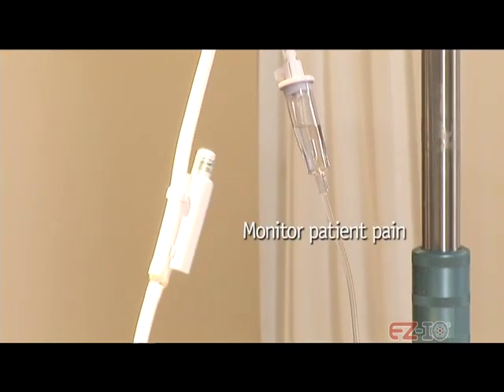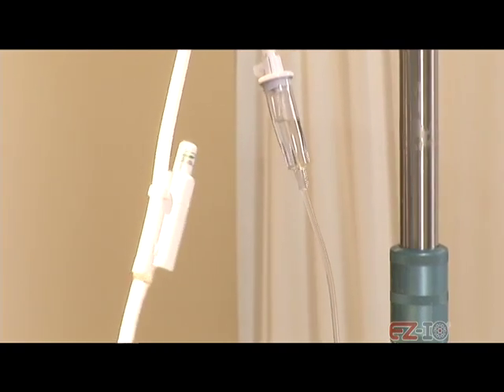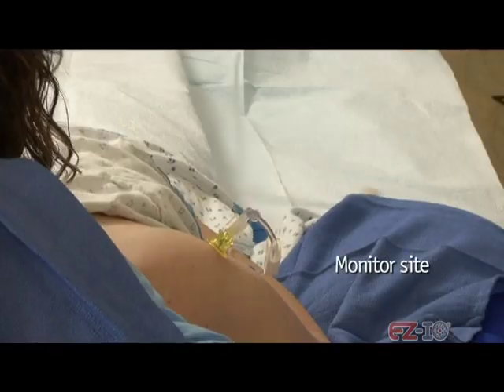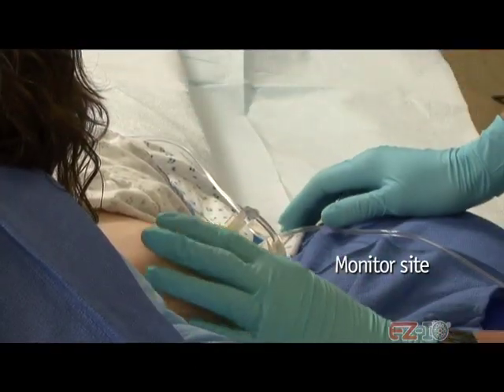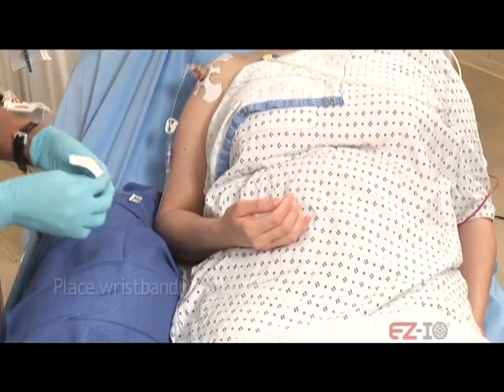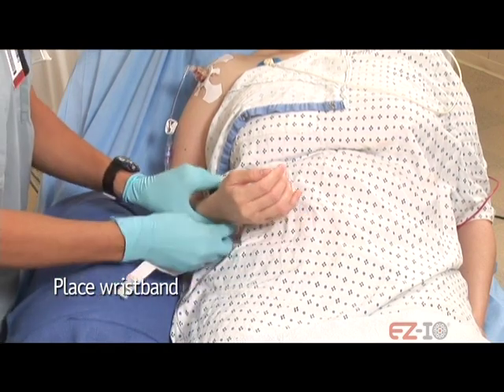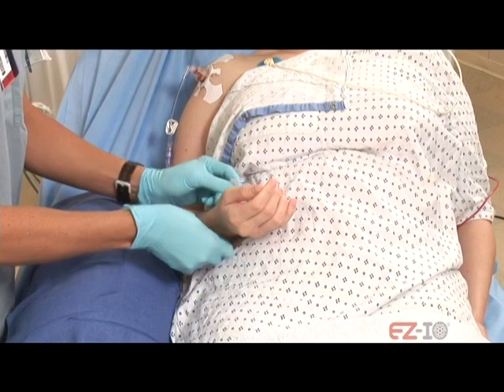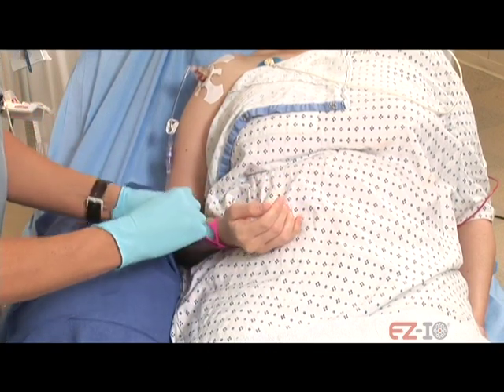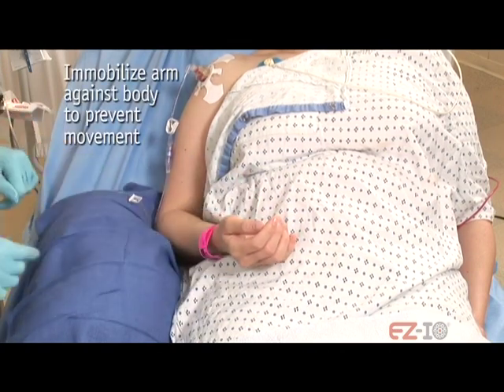Monitor the patient's pain during infusion. Consider repeating lidocaine as necessary for pain control as allowed by institutional policy and procedure. There we go. Monitor the infusion site for signs of extravasation. Good there. All right. Place the wristband on the patient, indicating the date and time of Easy IO placement. All right, that's it, and we're done.